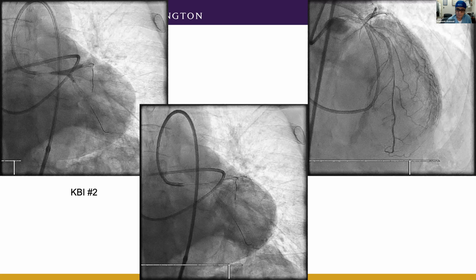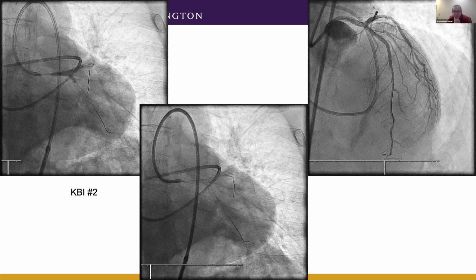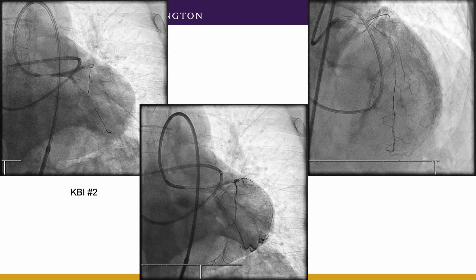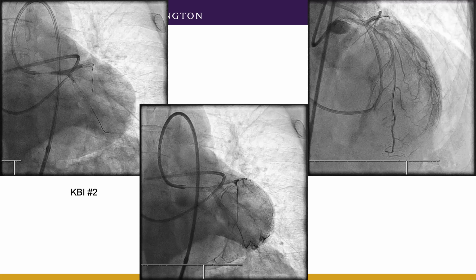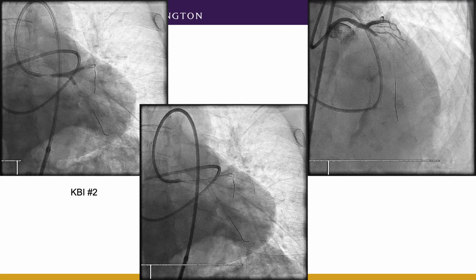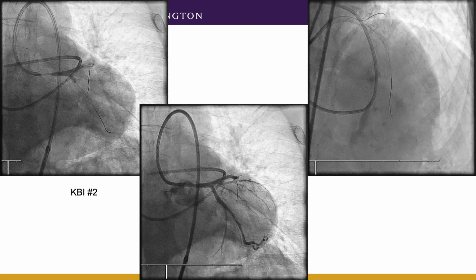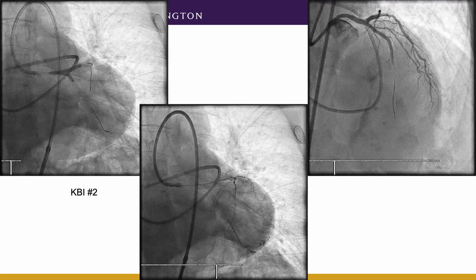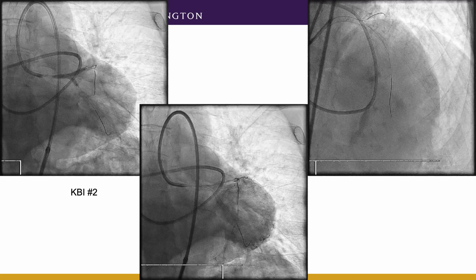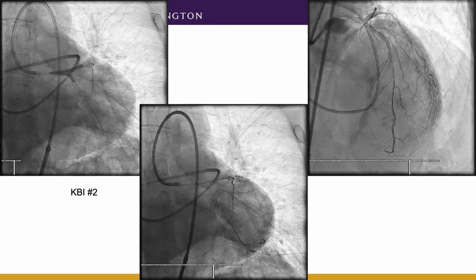I've been arguing with myself this whole time what bifurcation strategy I would even choose if you were to stent that. He had enough calcific disease right there too. I'm always mindful, because of our brachytherapy referral bias, of these stents where we mess up the LAD in that territory, or you get something that's imperfect. Not saying that would necessarily happen, but that was the part we struggled with for stent optimization. Anyway, we elected to leave that just to prioritize the LAD.